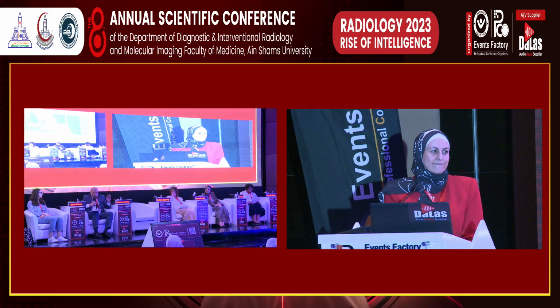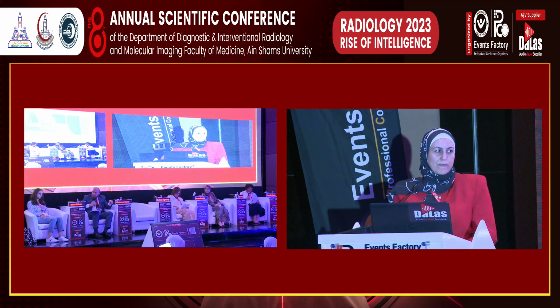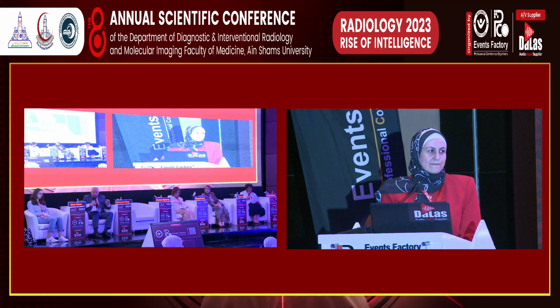I think PSMA PET changed the landscape of prostate cancer in all situations, for the clinician, the radiologist and the surgeon. And I think PSMA PET added much to define the patient with normal imaging, CT and bone scan, with elevated PSA. Those patients are very important to do a PSMA PET. My comment on your elegant lecture is that you do PSMA PET at initial presentation, because if you did it after treatment, you will be biased, as the patient may have progressed. So the value of PSMA PET should be in the presence of an initial PSMA PET.